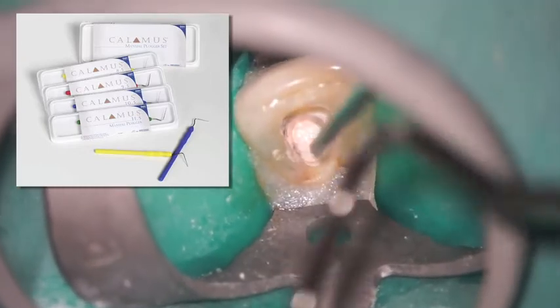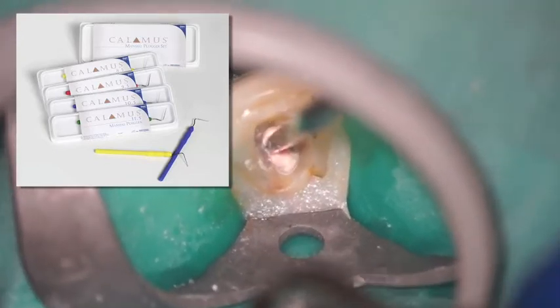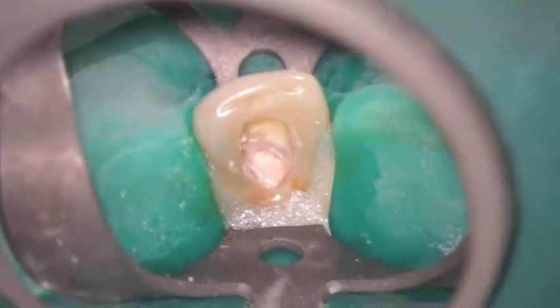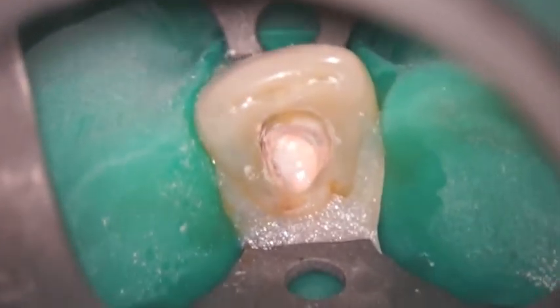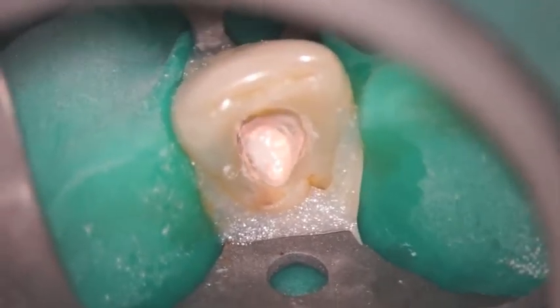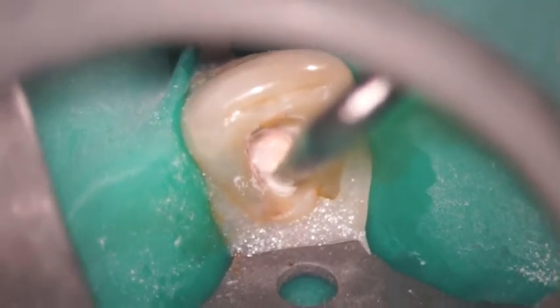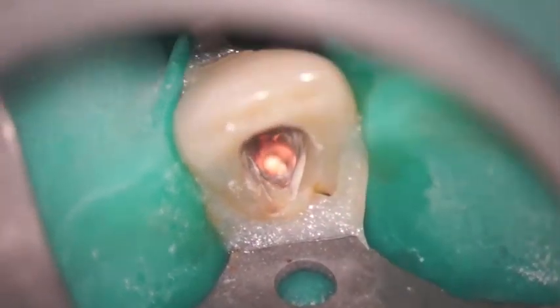My assistant will take that Calamus plugger from me — we might go to a smaller one or a larger one. The vivid illustration and being able to see it so well through a microscope gives you a tremendous amount of confidence in making certain that you're capturing all of the rubber in that access cavity and condensing it vertically.